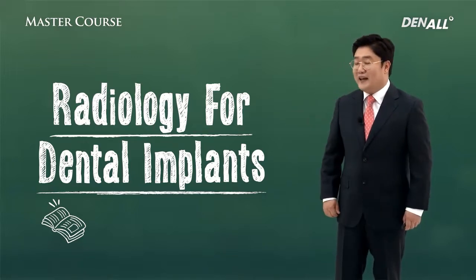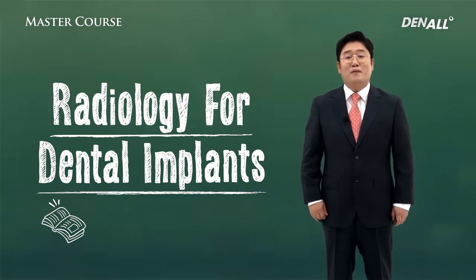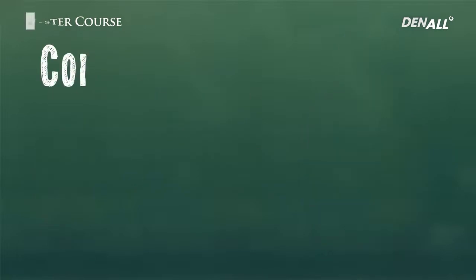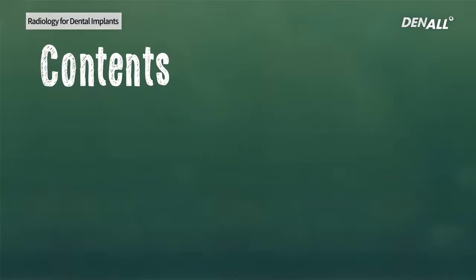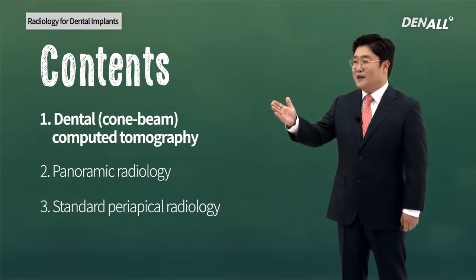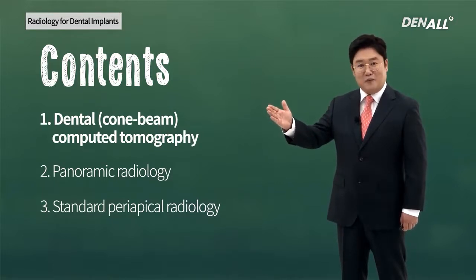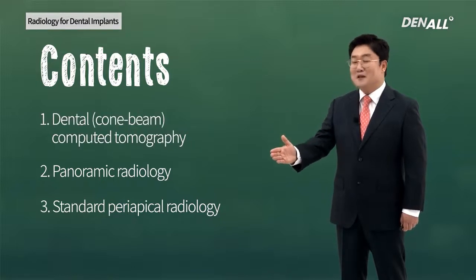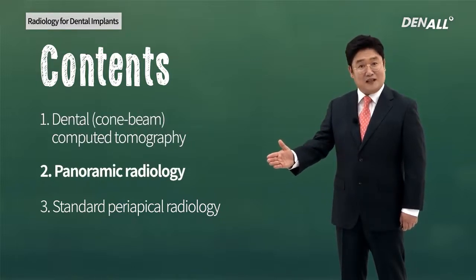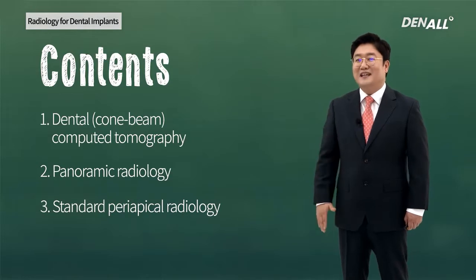Today, I will be presenting radiology, the basic image taking and interpretation. So let's have a look at the contents first. 1. Dental computed tomography or cone beam computed tomography. 2. Panorama, which you already know well. 3. The standard or standard periapical radiology procedure.